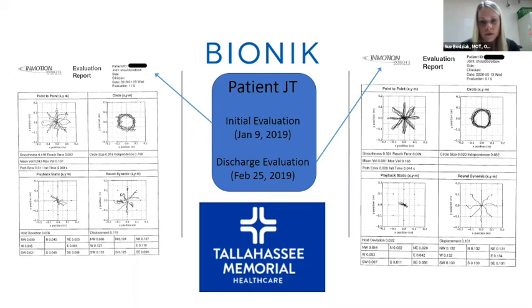It's a computer-based test, but there are similar visual motor tasks on the Drive Able that are similar to the robotic arm, especially for spatial judgment. So I will even work with people to get their spatial judgment a little bit better so they can do the Drive Able testing. So I even use it for that.